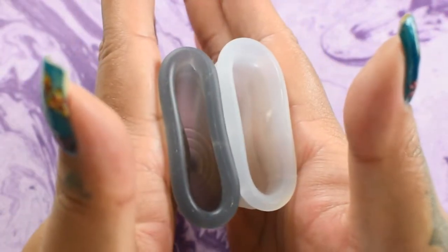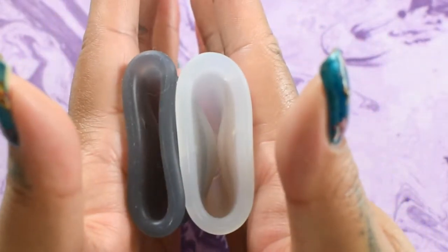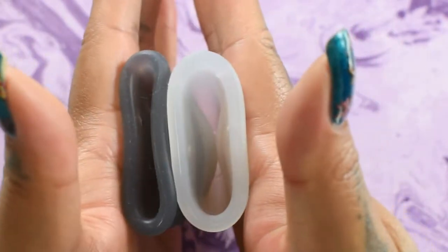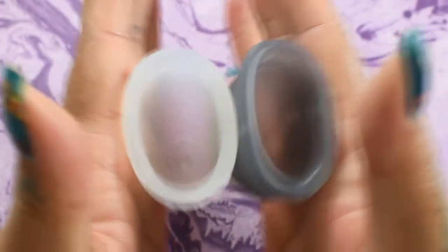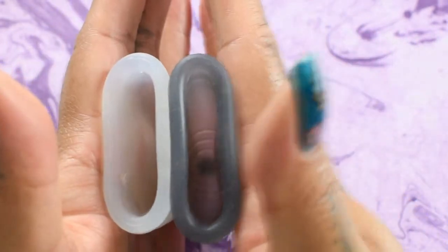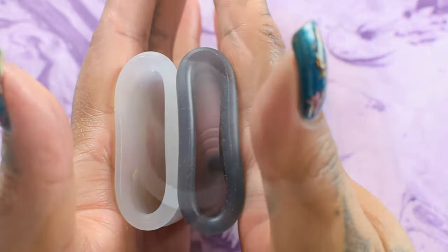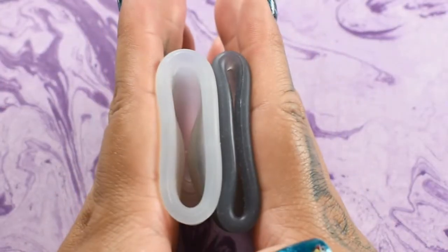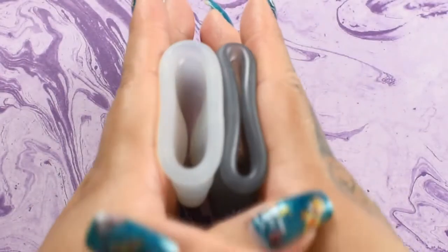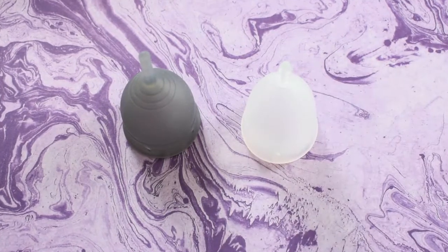Inside of the Organic Cup — again, these are both the small size. Inside of the Organic Cup and inside of the Salt Cup. And just the rims. That was the soft Salt Cup and the Organic Cup, both in a size small.